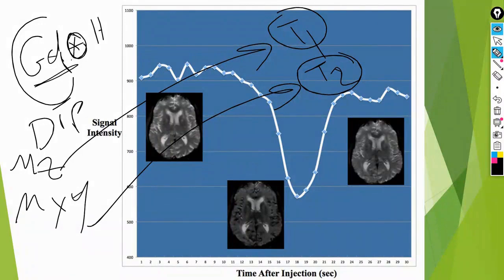Is that absolutely clear? Why does the presence of the contrast agent reduce the T1 constant? Because it causes the protons to spin more rapidly in accordance with the surrounding protons due to a change in the system. Reducing T2 follows the same idea. It accelerates energy loss in the process, making the decay that occurs in the XY plane faster.